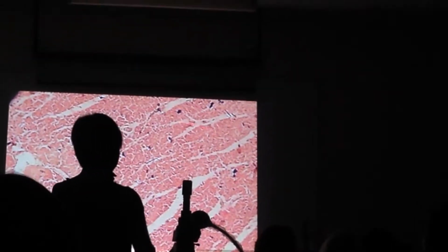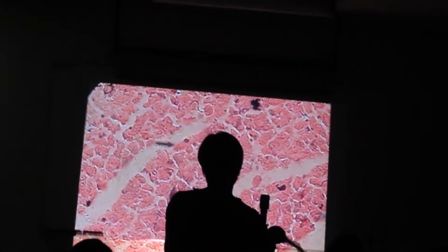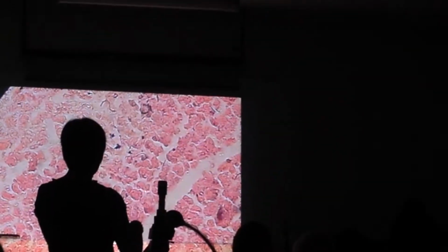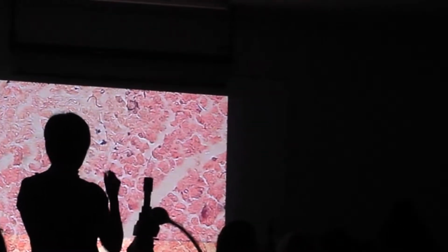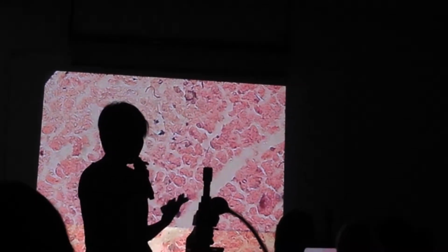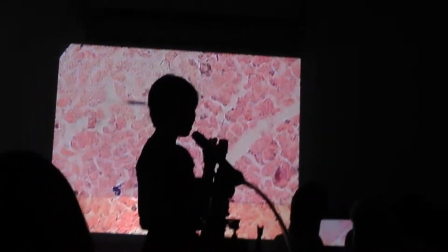So this area generally parang pink, diba? But when you look at this, it assumes a golden brown color. And then the pigments should be deposited within the cytoplasm. So this area here, you see small granules within the cytoplasm, yellow to golden brown, and this one, you only have pink cytoplasm. So lipochrome accumulation is just a reflection of the aging process.